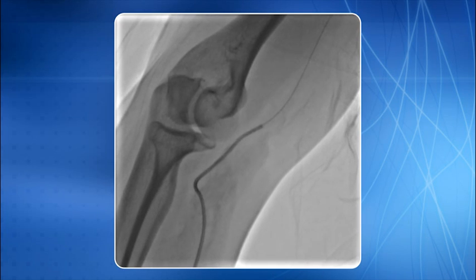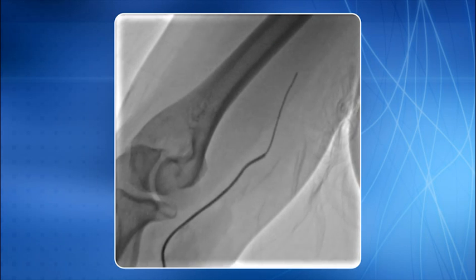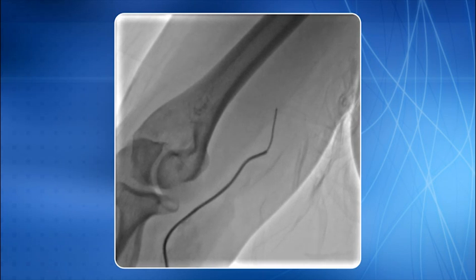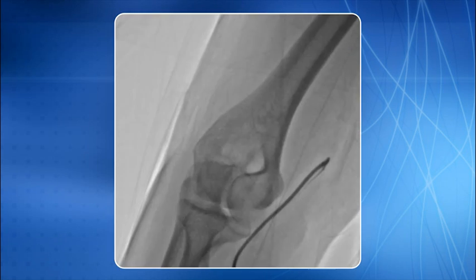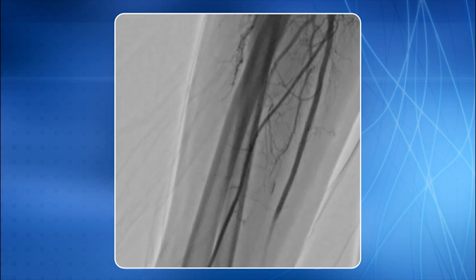The catheter is carefully negotiated using a gentle corkscrew movement across this segment. Once the distal tip of the catheter has reached beyond the loop, the PTCA wire was removed and replaced by a 0.032-inch standard wire. The diagnostic catheter was now removed and replaced by a 5F guide catheter, which could be easily negotiated through this region. Coronary intervention was then completed. While coming back, we documented the loop and the sealed perforation.